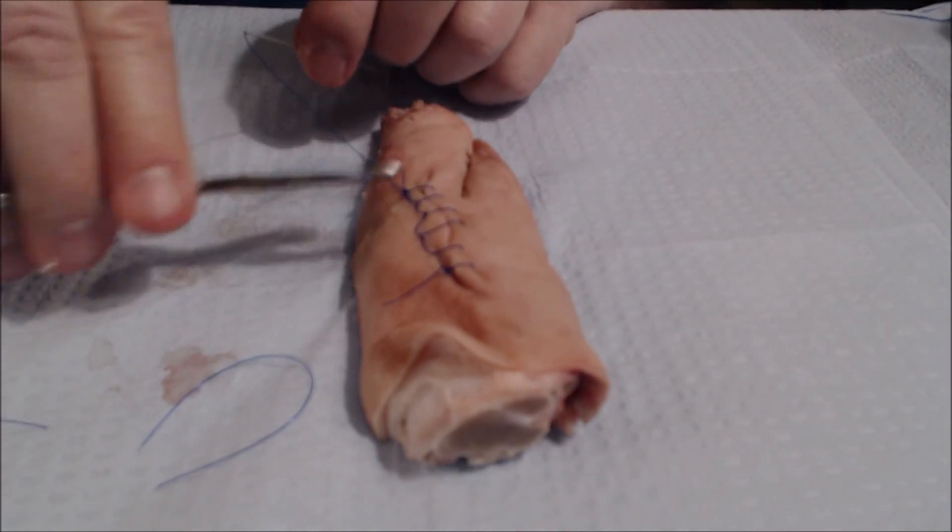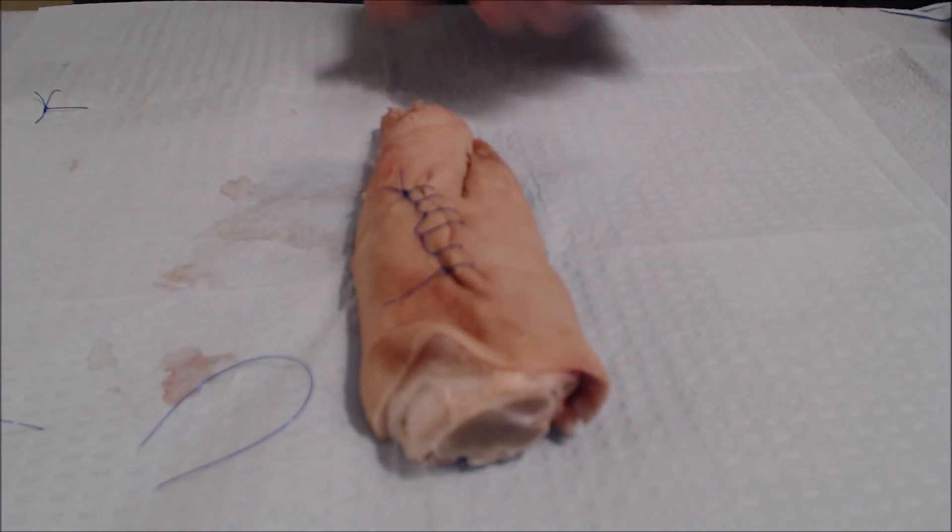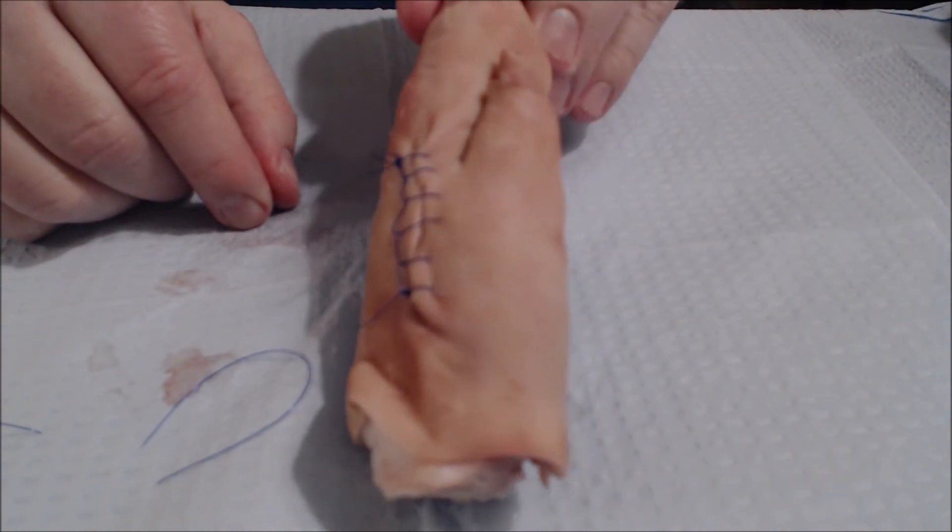Here we cut the ends like so. And we have a running, locking suture.